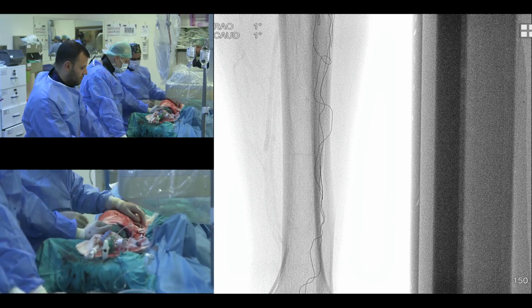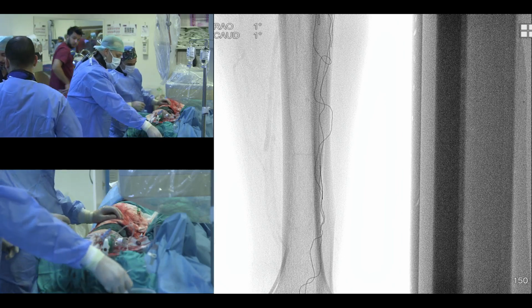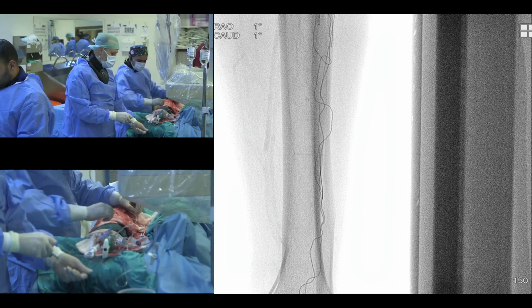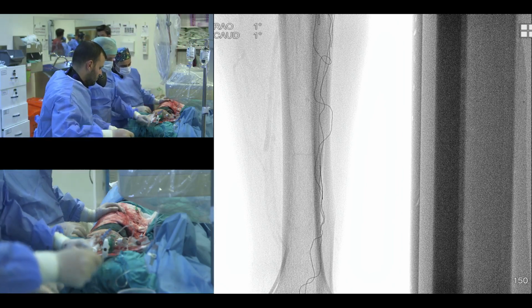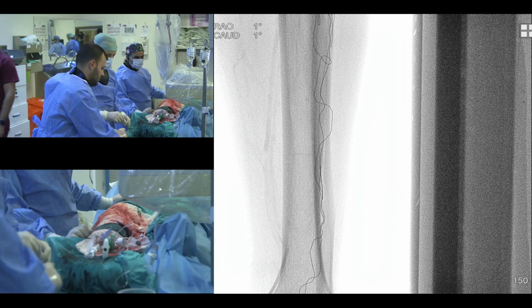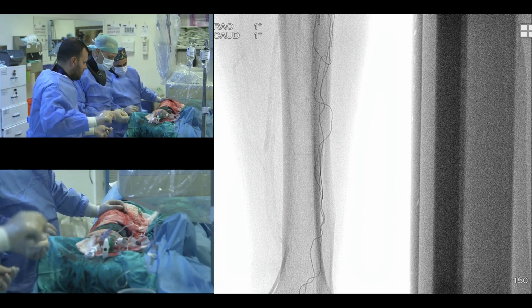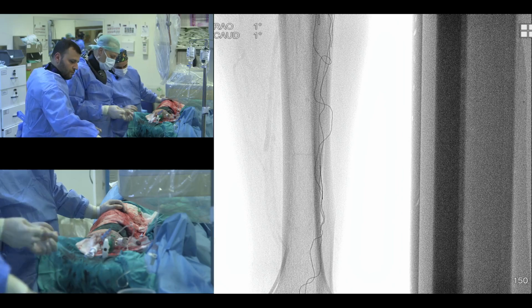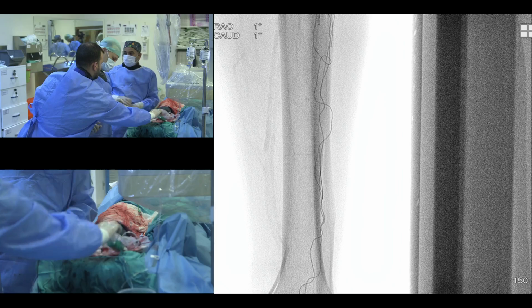Got an MRA. You see that on the left side, it's rotating. Would you click the right side? Excuse me. Would you click the right image on the screen? Just click that and it will play. And on the bottom, there's a play button. I'm sorry. I have a mouse. I'm sorry. My apologies. Let me see.